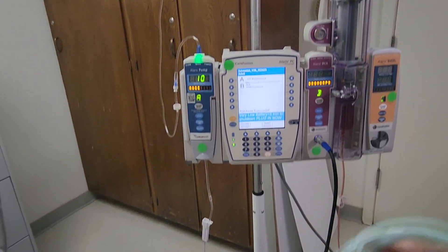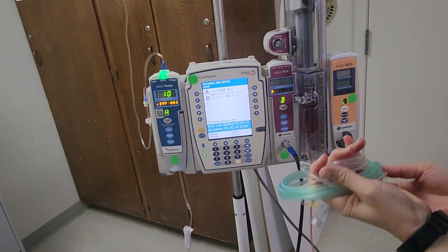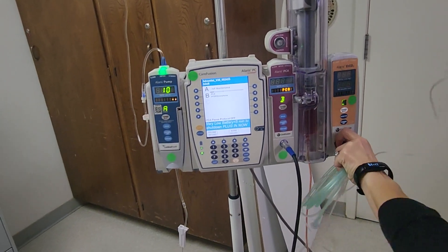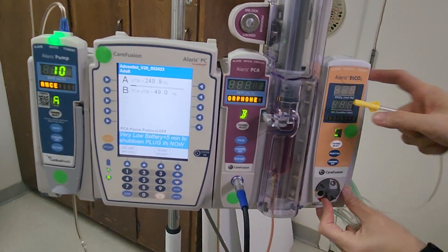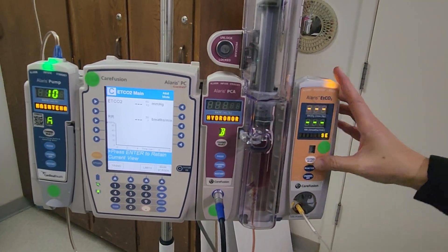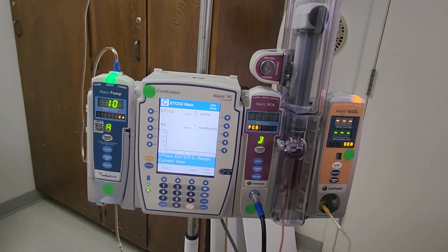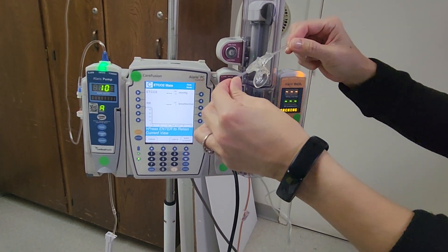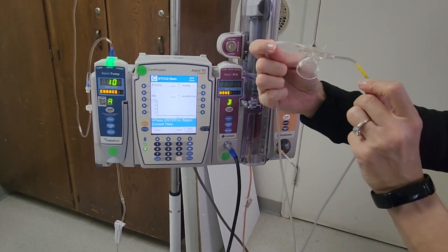This is the end tidal CO2 tubing. There is a yellow end here — if you twist this portion, you will see the yellow goes to yellow. Turn that clockwise to turn on the channel. The prongs go into the patient's nares and the reservoir will capture the end tidal CO2.